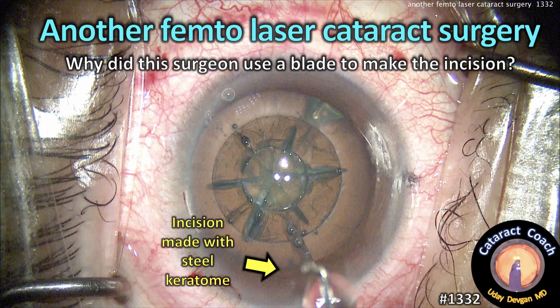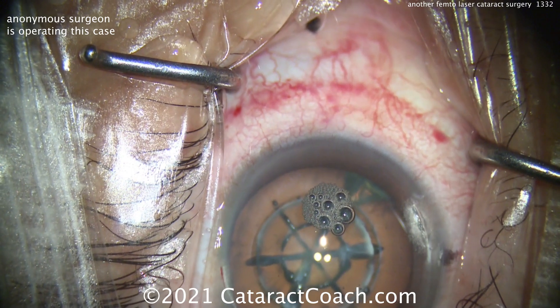CataractCoach.com — another femtosecond laser cataract surgeon. So why did this surgeon use a blade to make this incision? Check it out.